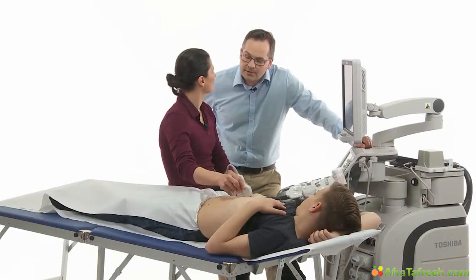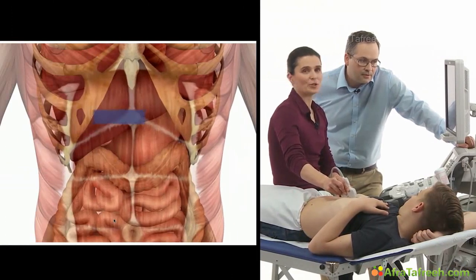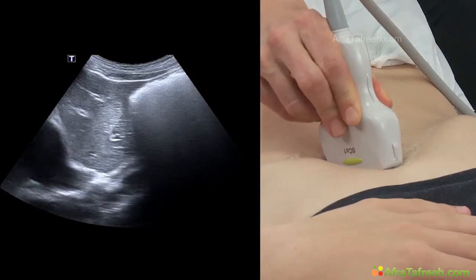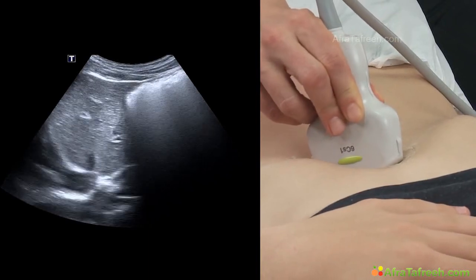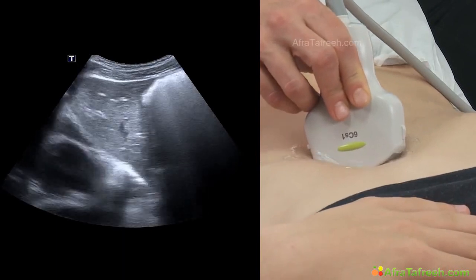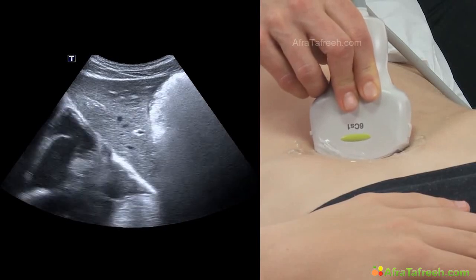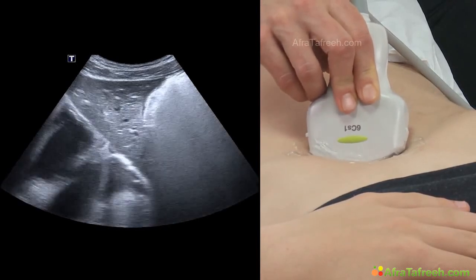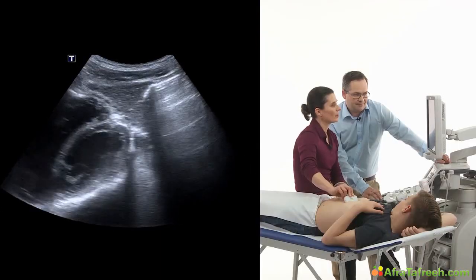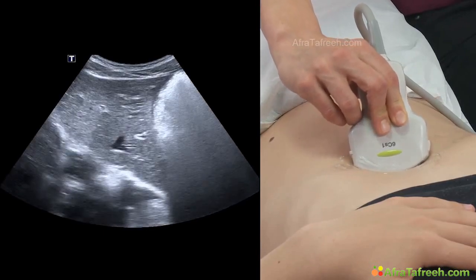Can you show us the very left liver segments again in the second plane? Yes, certainly. I start from this longitudinal position again, and now I turn my transducer slowly anti-clockwise into a nearly transverse position, but I have to adjust to the left costal arch. And I ask my patient to inhale and hold his breath. And then here we got the left liver lobe in the other plane, and I slowly tilt my transducer and perform a sweep of the left liver lobe until the very last tip, and slowly sweep back again so you can easily observe the tissue over here.